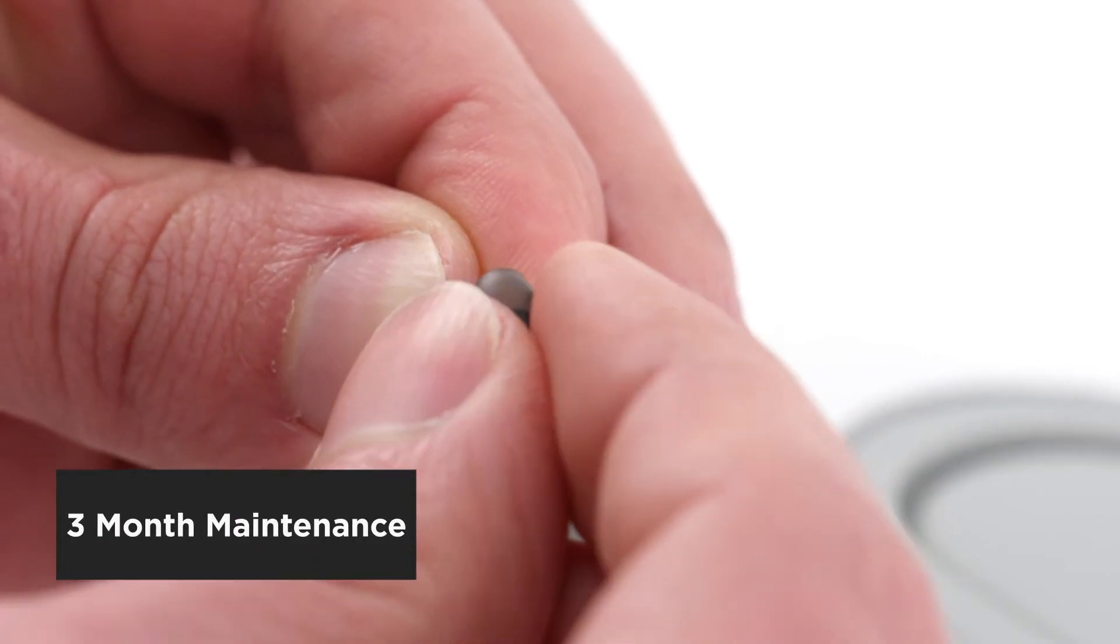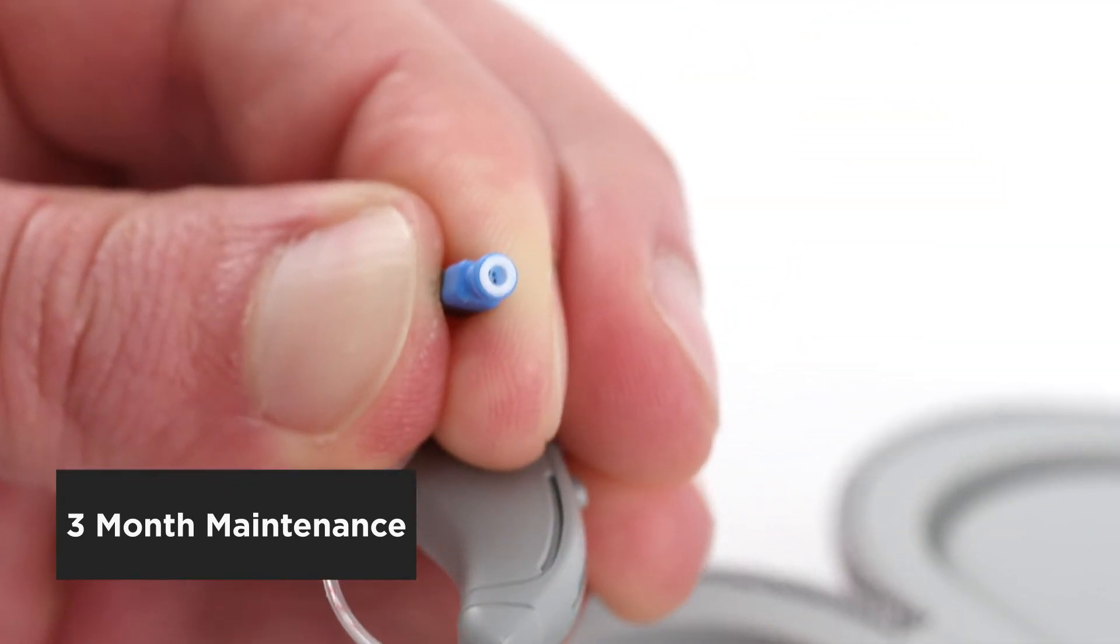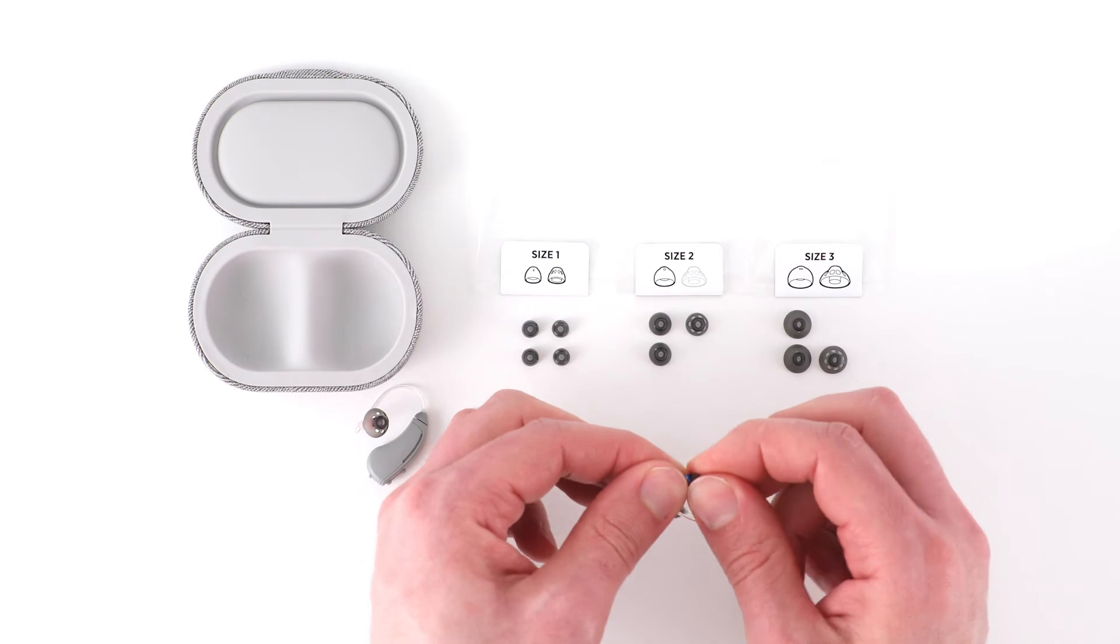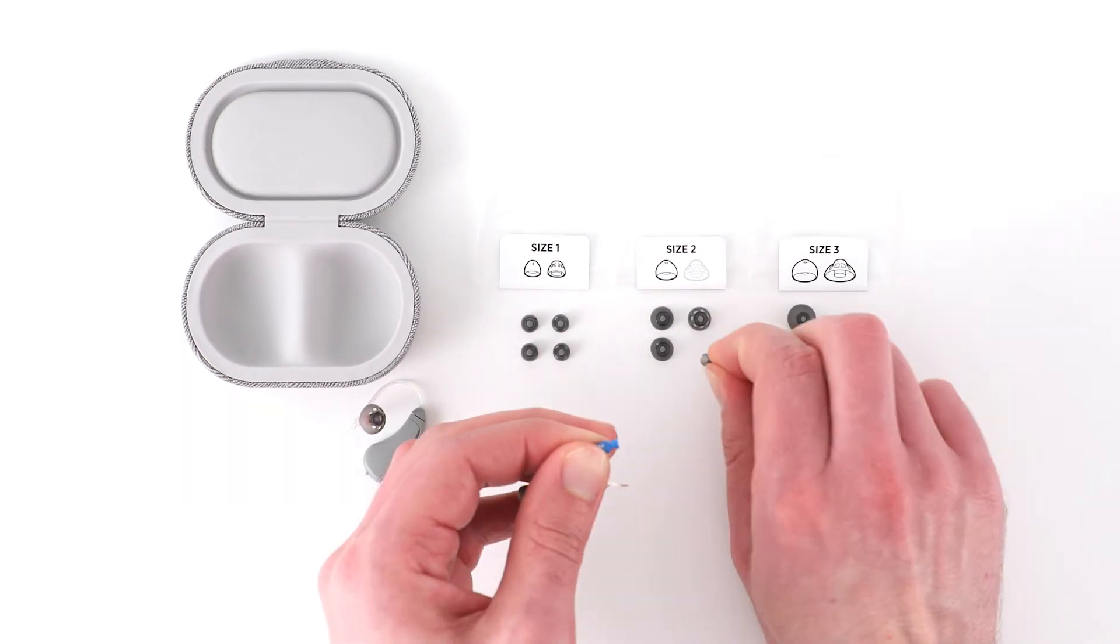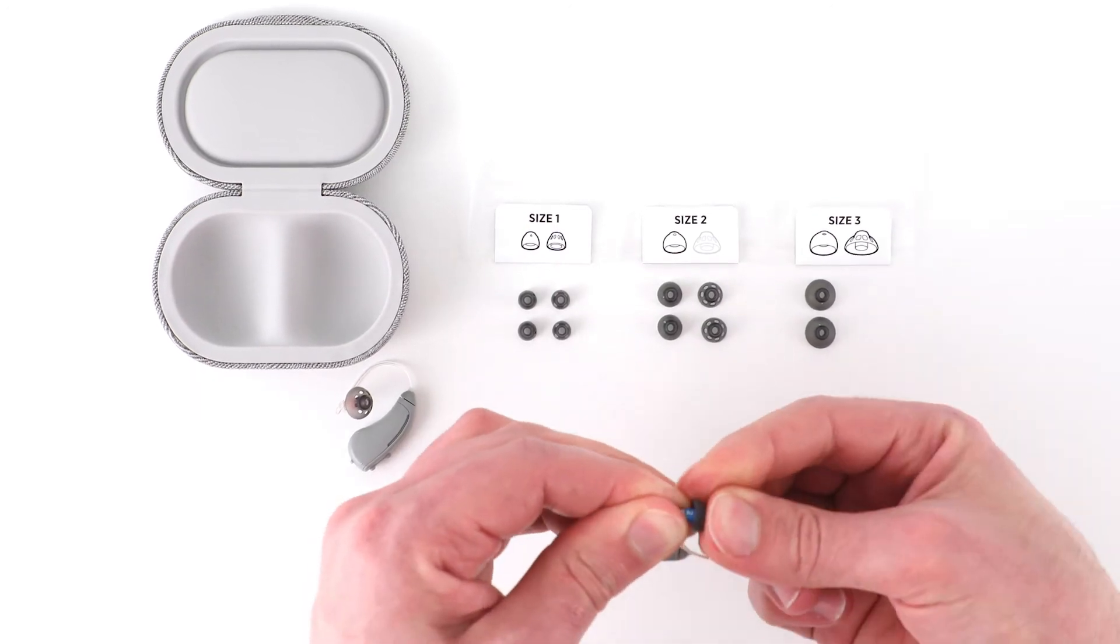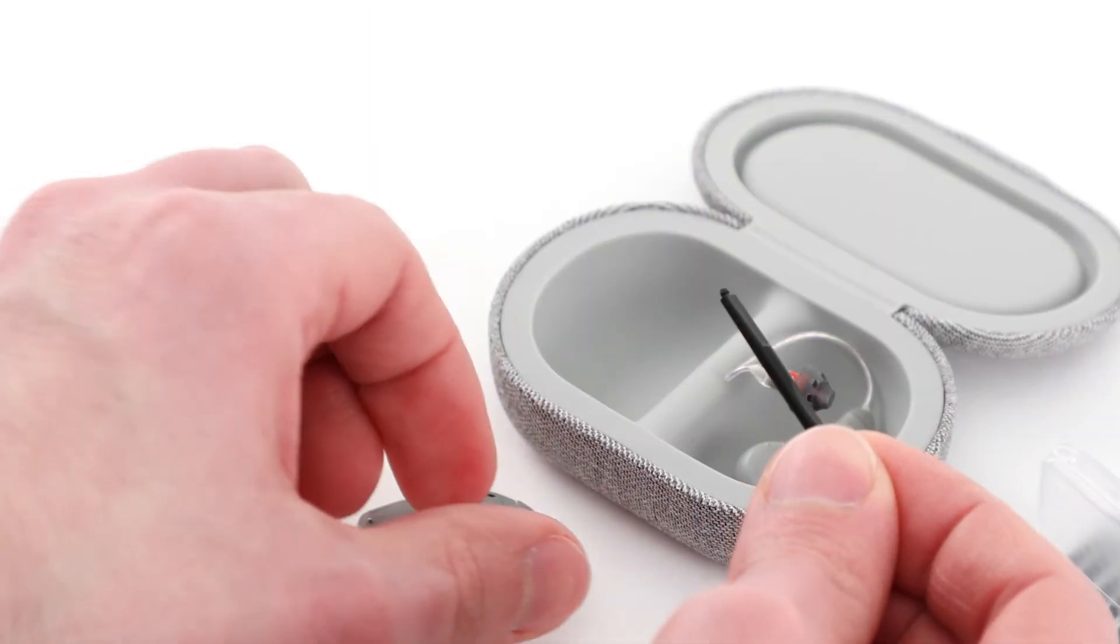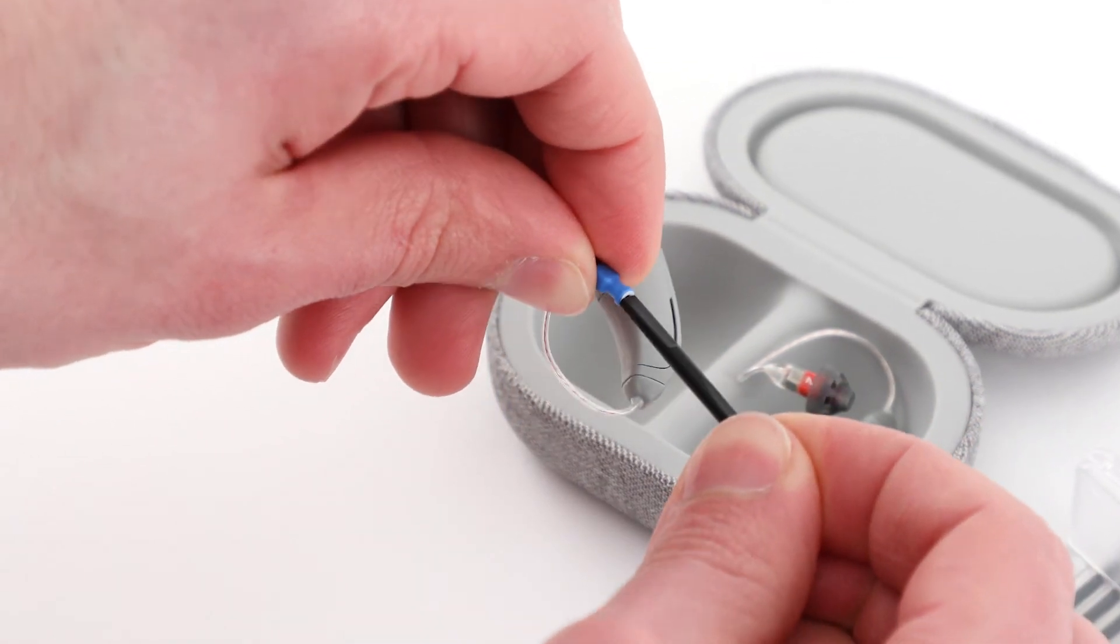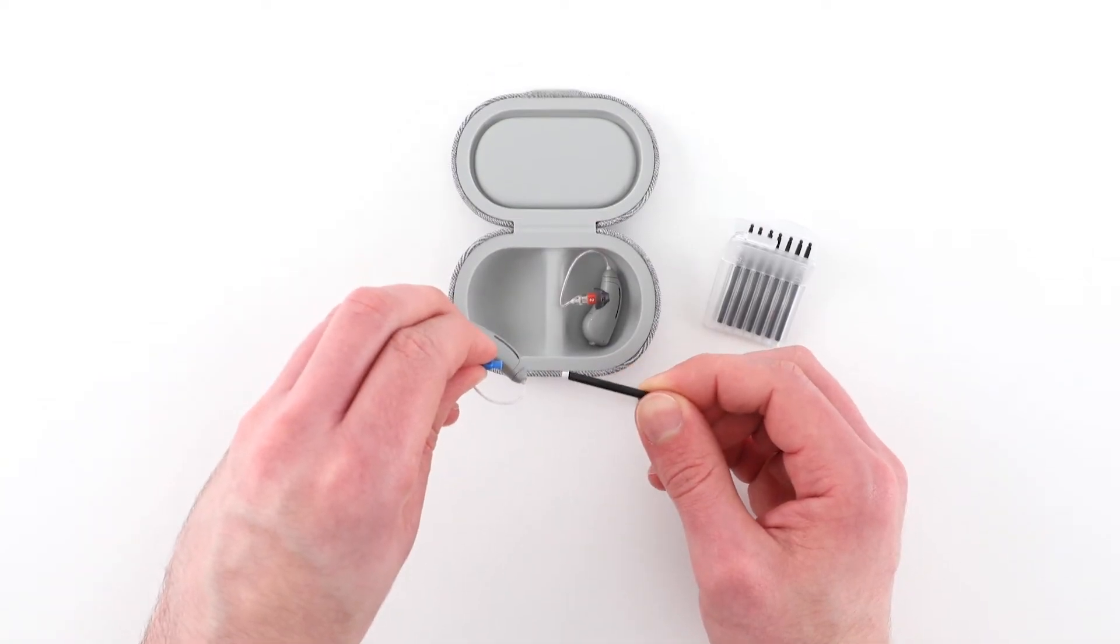It's recommended to replace the ear tips and wax guards every three months to mitigate wax buildup. However, this can vary by individual. Replace the ear tips immediately if they become discolored or stiff, or if they fall off when you remove the hearing aids. Replace the wax guards if they get blocked by earwax buildup, or if you notice that the hearing aids sound quieter than usual.